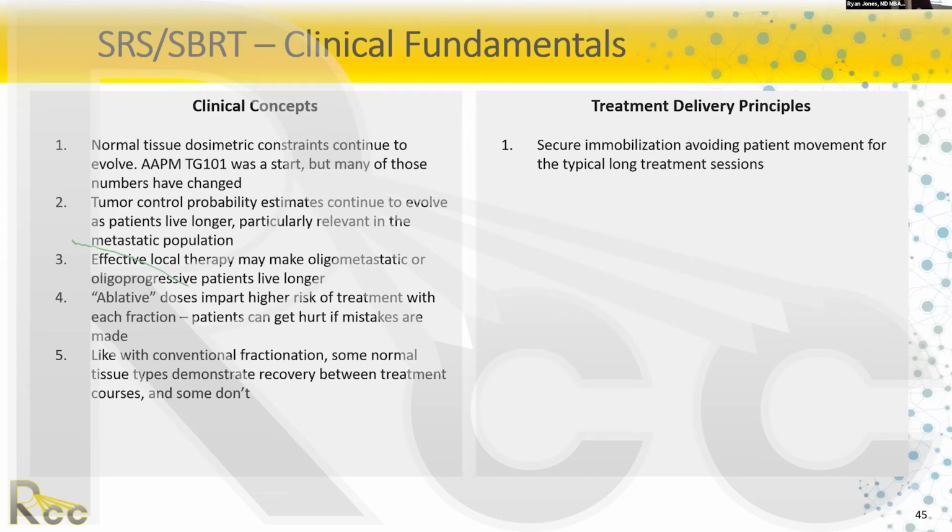Contrast that to what I saw a lot of at UT Southwestern, 3D non-coplanar. So maybe 13 non-coplanar beams modeled out, where we know these treatments are remarkably conformal. They have a nice concentric fall off in all directions, but they take a long time at the machine. We were blocking sometimes 50 minutes plus for these treatments. You've got couch kicks and just even getting to the different field positions. And you want secure immobilization to make sure the patients don't move. You need accurate repositioning from simulation to treatment, so you don't have, for example, flexing of the spine, throwing off issues on pitch or yaw.